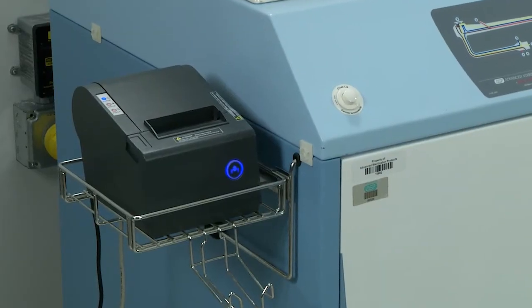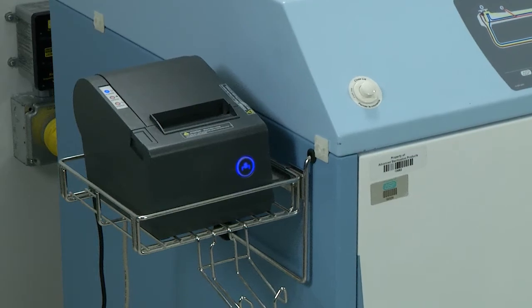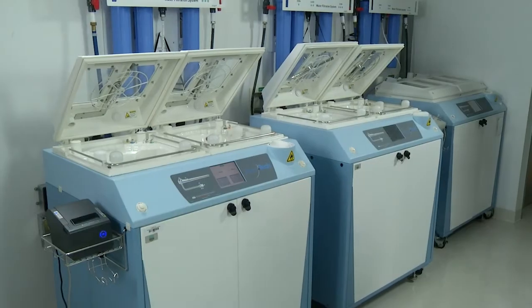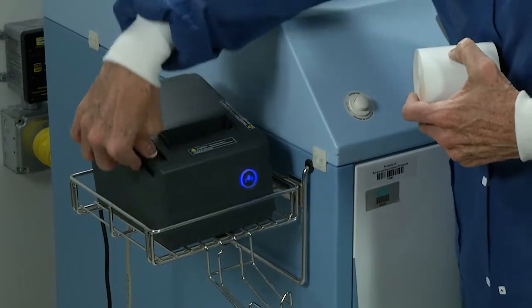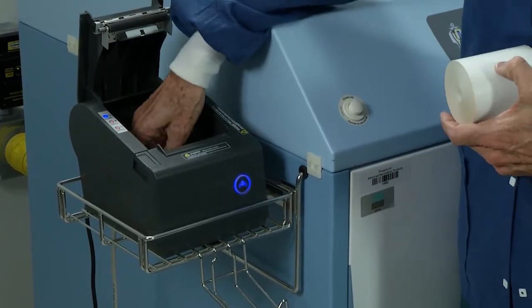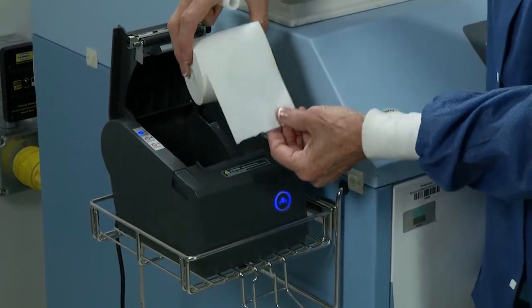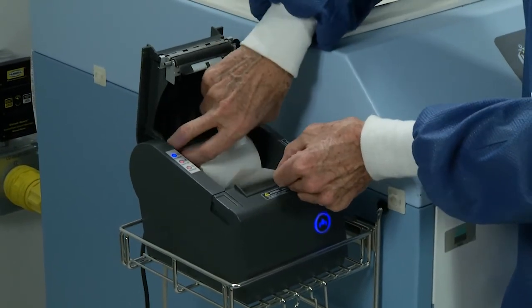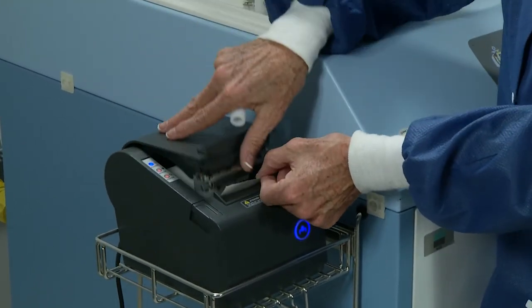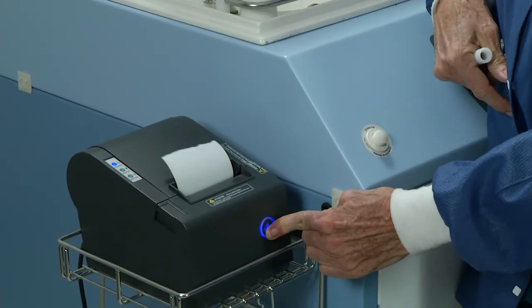The printer is a thermal printer. If the paper is wrong or inserted backwards, the printer will not print. To change the printer paper, open the unit by pushing the Open button. Remove any unused paper and replace it with a new roll by placing it in the tray so that the paper comes from underneath the roll. Pull out enough paper so that it extends outside the printer. Close the lid, then use the button provided on the front of the printer to advance the paper.